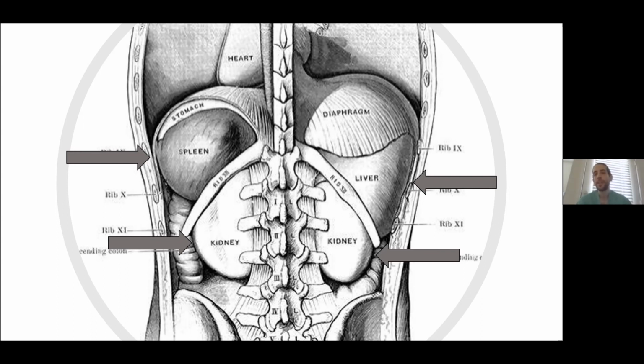So if we're going to do intravenous contrast, it's not clear that that's actually going to visualize bladder lesions, but some are investigating that. And regarding kidney lesions, you will clearly see parenchymal kidney lesions, but the collecting system isn't always visualized as well because, as you know, the contrast agents don't necessarily make it all the way through the nephron and get filtered out before it gets into the collecting system. So it's difficult, not impossible, but very difficult to see collecting system injuries.